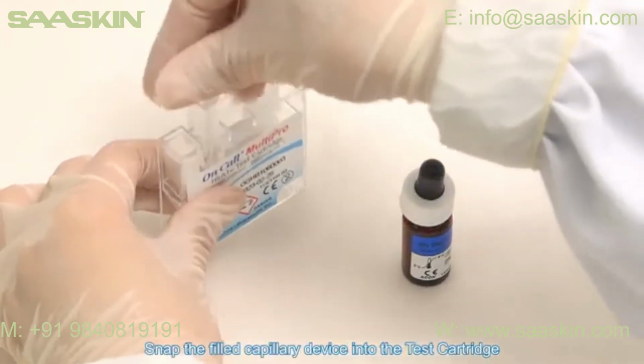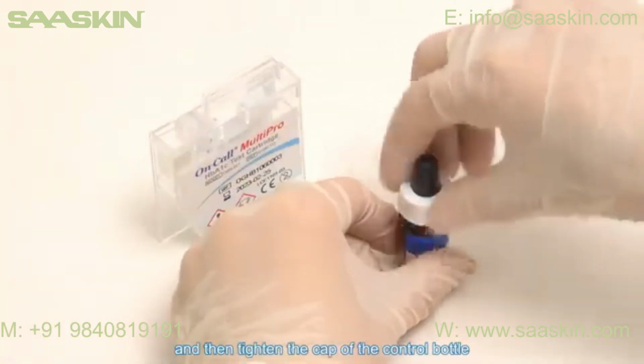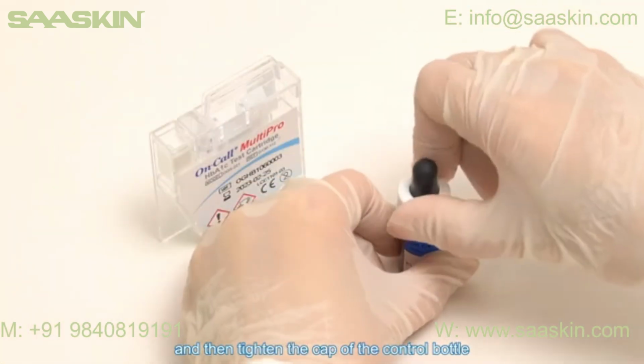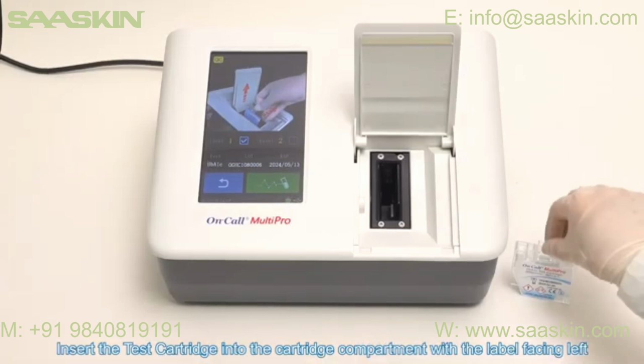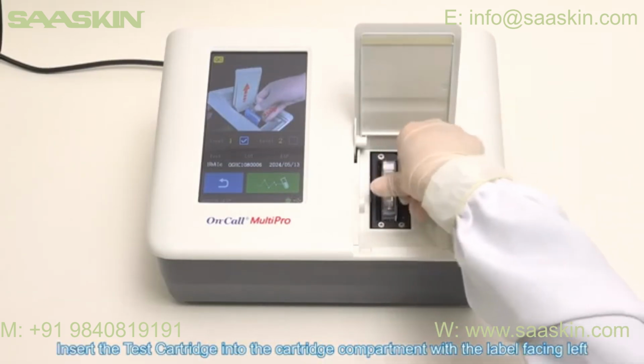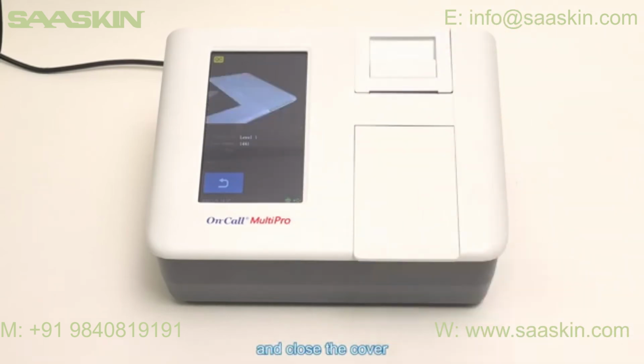Snap the filled capillary device into the test cartridge and then tighten the cap of the control bottle. Insert the test cartridge into the cartridge compartment with the label facing left. Click Test button on the screen and close the cover. The QC test will start automatically.